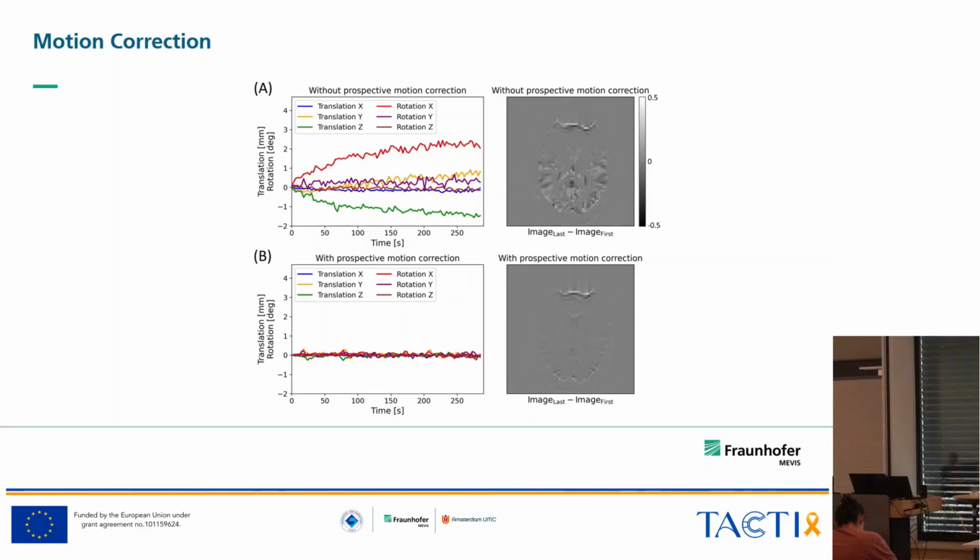So this is, I think, a 5-minute acquisition. At the top, the subject was told to not move, but there were no head restraints. And without head restraint, you can think about 1 millimeter or 1 degree in rotation of motion per minute.